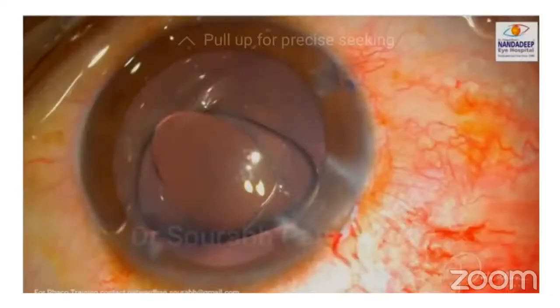Here in this case, you can see there is a posterior capsular breach through which the oil is entering into the anterior chamber. This situation can be tackled by injecting enough viscoelastic and forming the anterior chamber, followed by slow removal of silicone oil. And since the rent is big, you can implant the IOL in the sulcus, and optic capture has to be done.